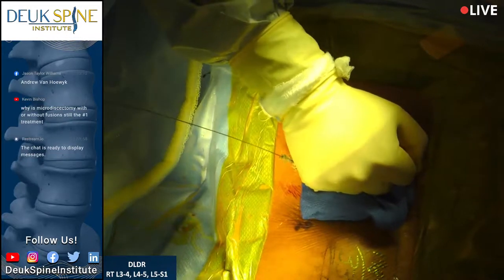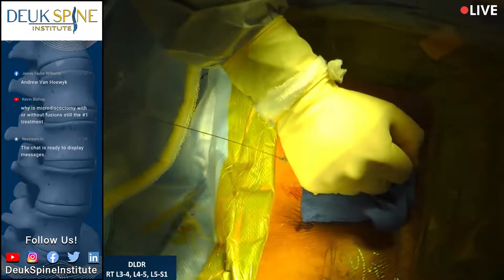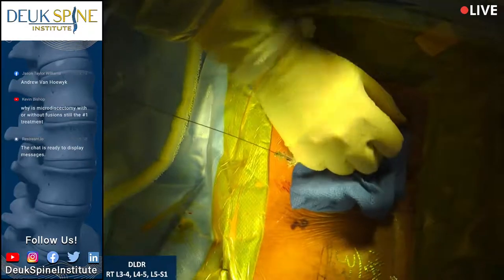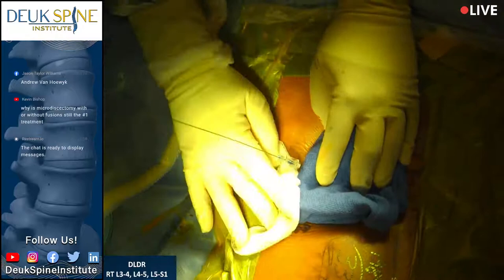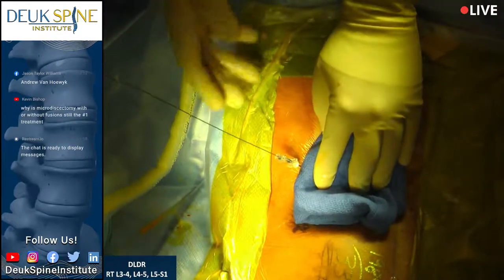Okay, we are gonna finish this surgery with one more disc that we're repairing. That's the herniated disc at L3-4. Just to remind you, in case you missed the beginning, we tested these discs to see which ones are causing pain, and all three of them caused his pain. So now we're gonna fix the last one.